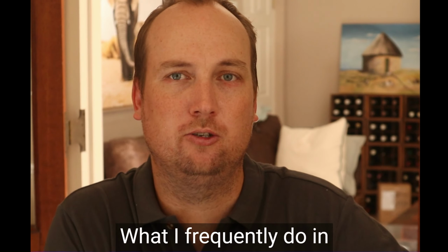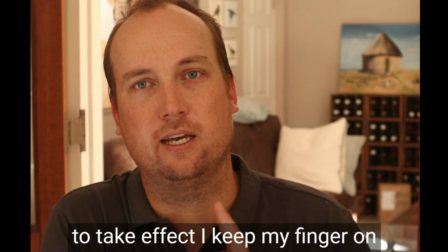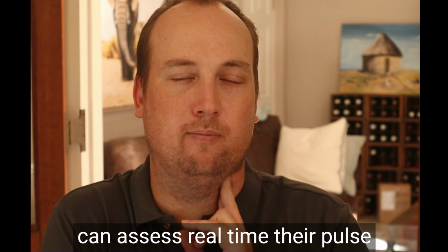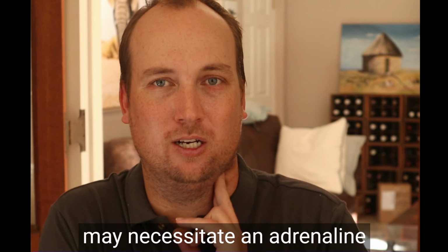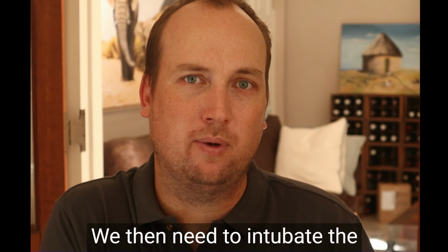What I frequently do in these high-risk situations is, while I'm waiting for the drugs to take effect, I keep my finger on the patient's carotid pulse, so I can assess in real time their pulse volume and their heart rate, and I can detect changes that may necessitate an adrenaline bolus or initiation of CPR. We then need to intubate the patient.